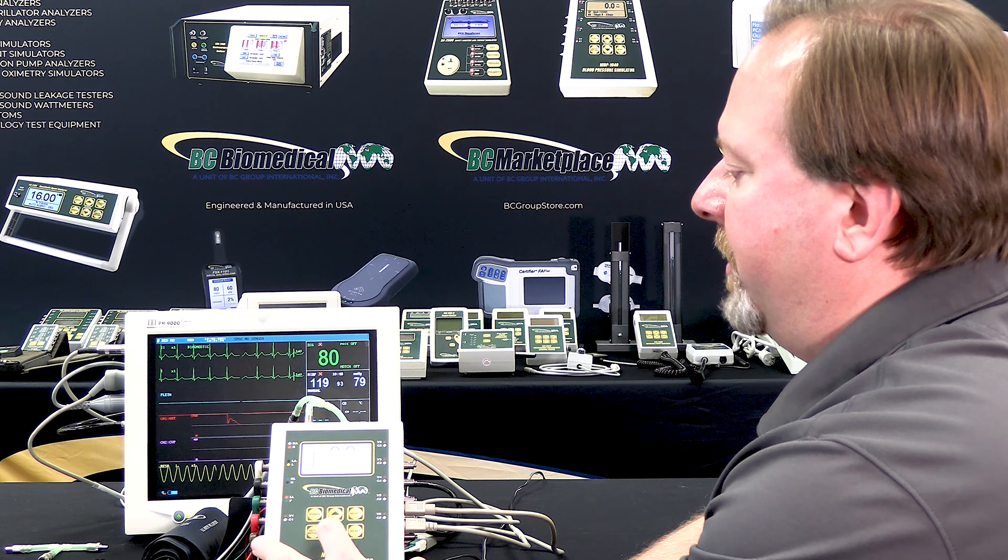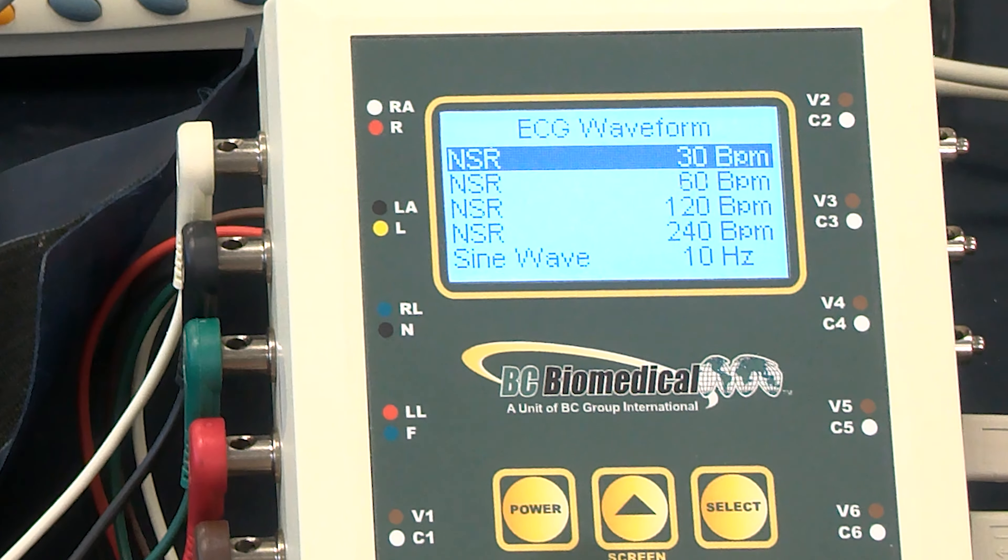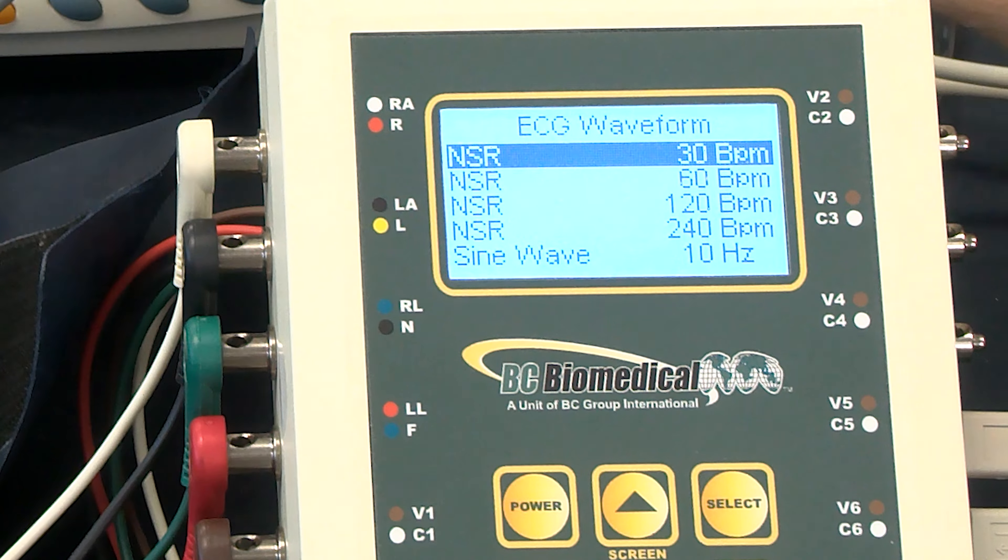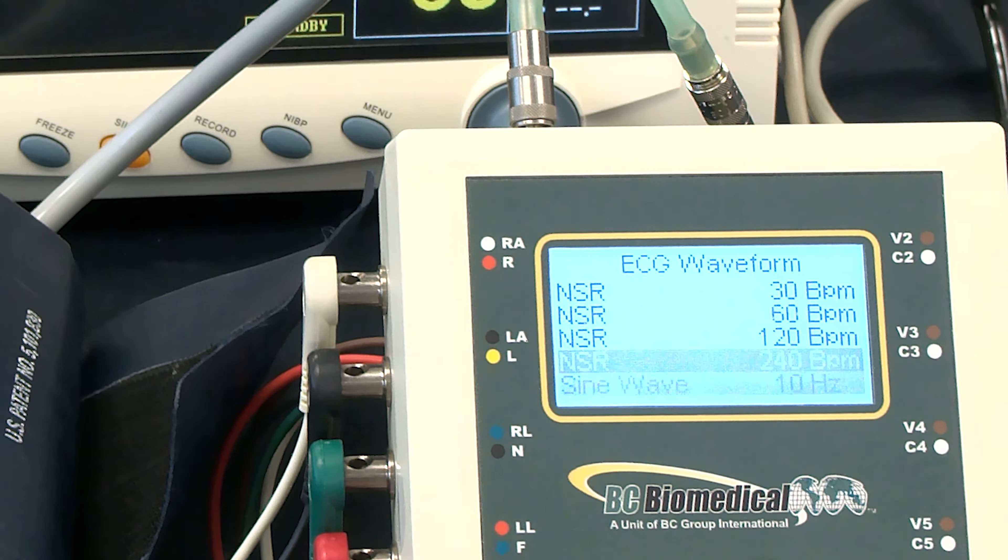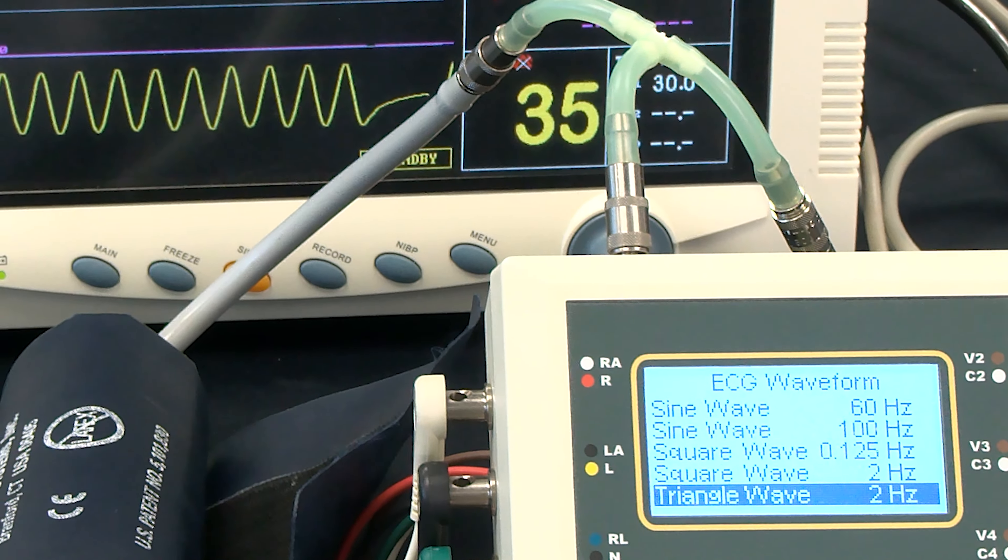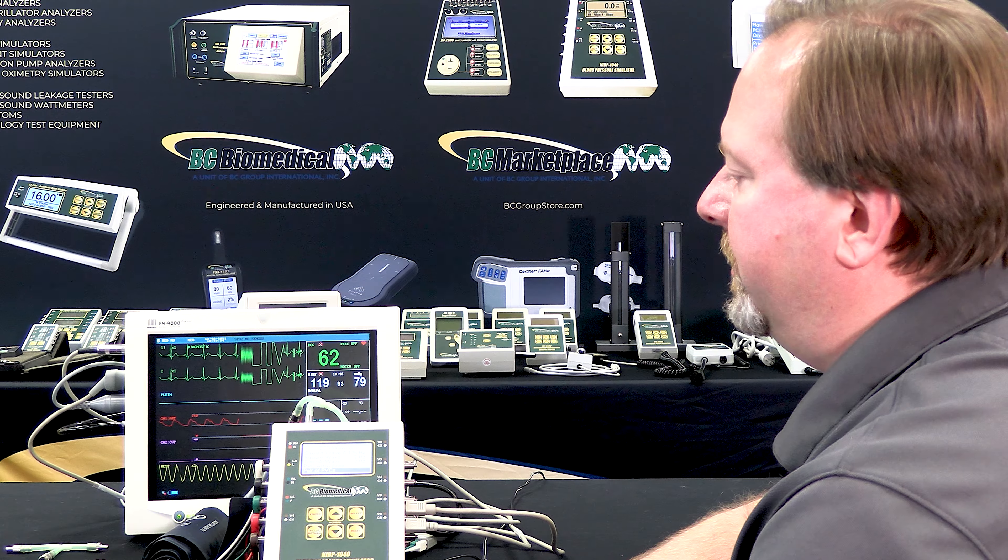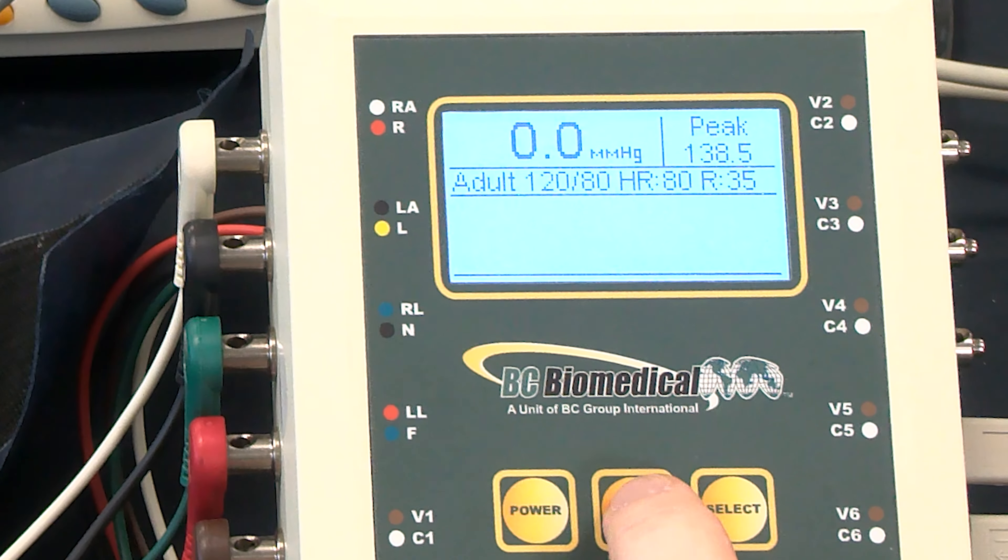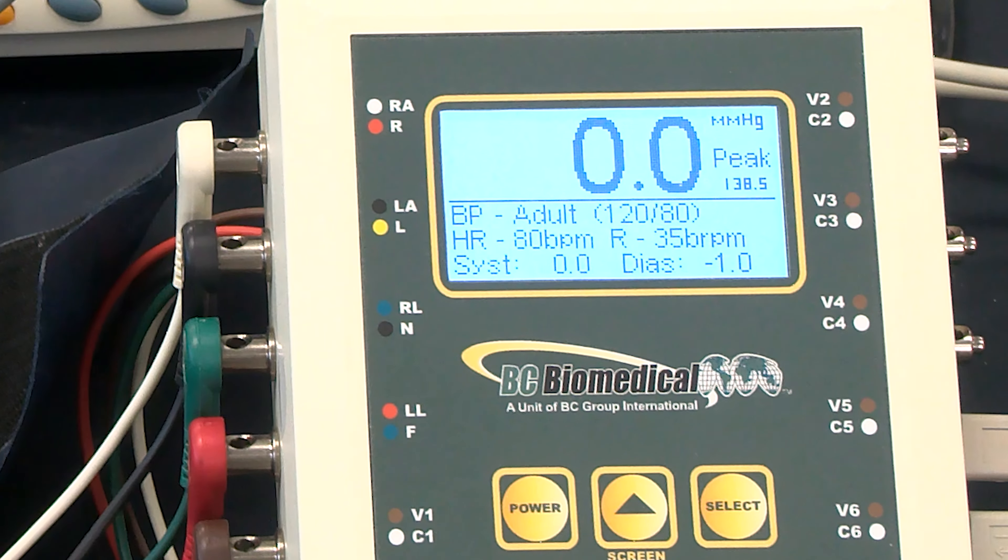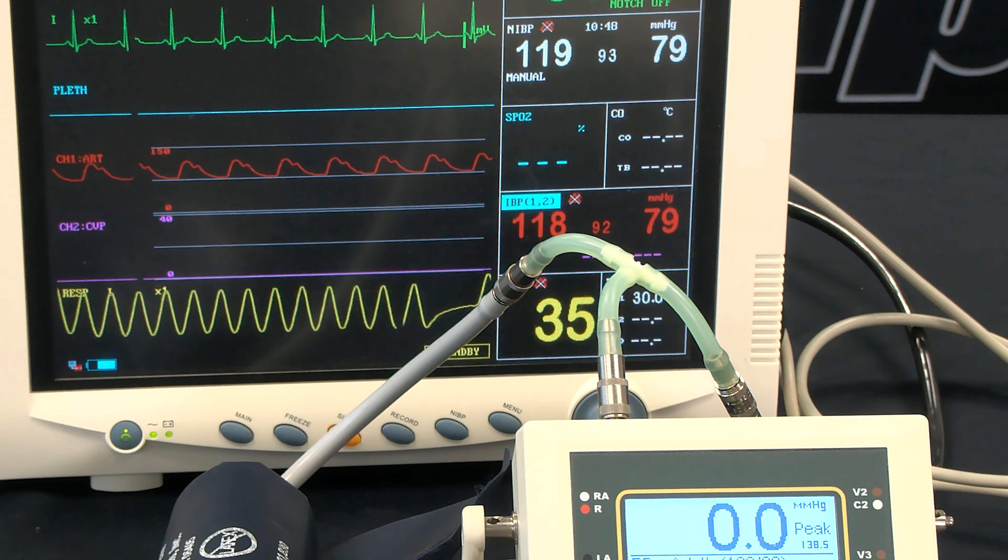Additionally, when we go to the ECG simulation screen, the IBP rate will be synchronized with either the normal sinus rhythm or the arrhythmia waveforms. The IBP arrhythmia will also be shown to the monitor, and again to get back to the main screen, we press the up arrow and we get back to our home screen, and we can see that it simulates a normal sinus rhythm in the invasive blood pressure at 120 over 80.